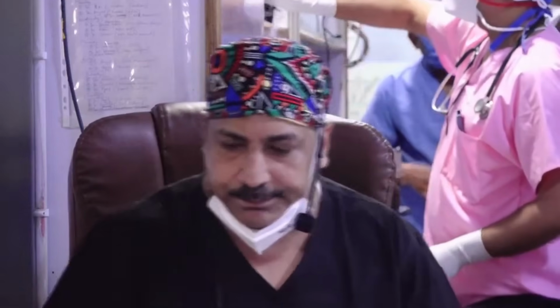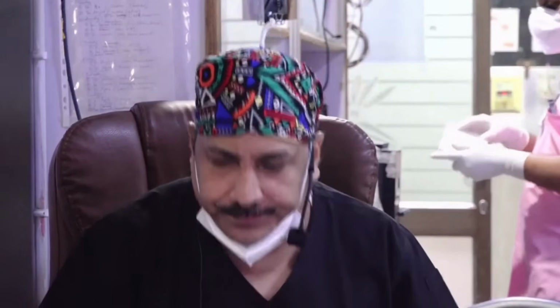Yes, Ravi? No, I was just inquiring about this doubt about you using 20 watts and then you used mechanical. In this case, yeah, Ravi, I tell you, that's a very important thing. Majority of the patients, when you have a blue footplate, not a thick footplate, you get through with a single 20 watt shot into the vestibule. It takes up the footplate thickness completely in one shot.